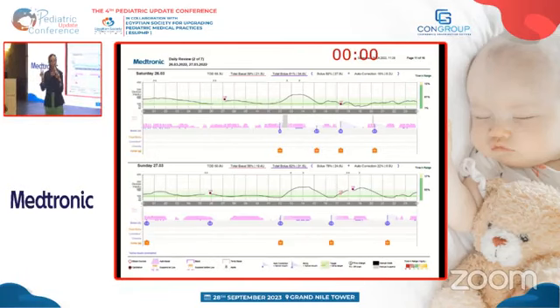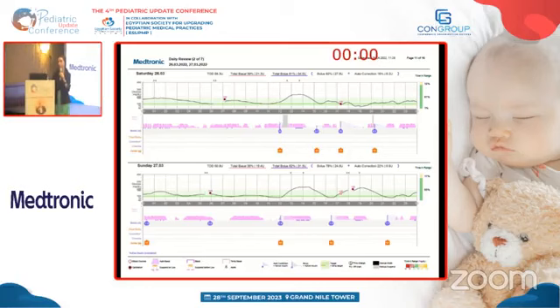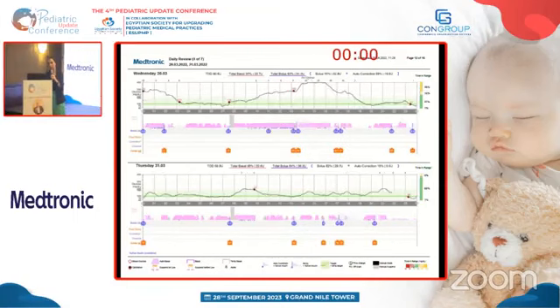فال 83% تايم رينج لو البيشنت حسن معايا الجزء ده هلاقيه على طول ان هو وصل لان هو يكسيد 90% تايم رينج على مدار التو ويكس، وهلاقي الجي ام اي بتاعه بدل ما هو 6.7 ده انا كمان هلاقيه اقل من 6.7. فلو مشينا مع يوم بيوم هنلاقي هو نفس الشكل بالظبط بيحصل مع البيشنت بتاعي.